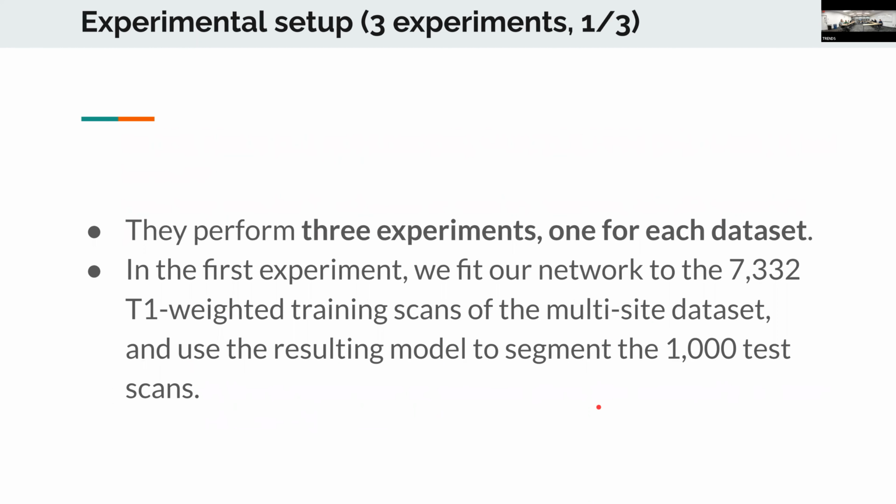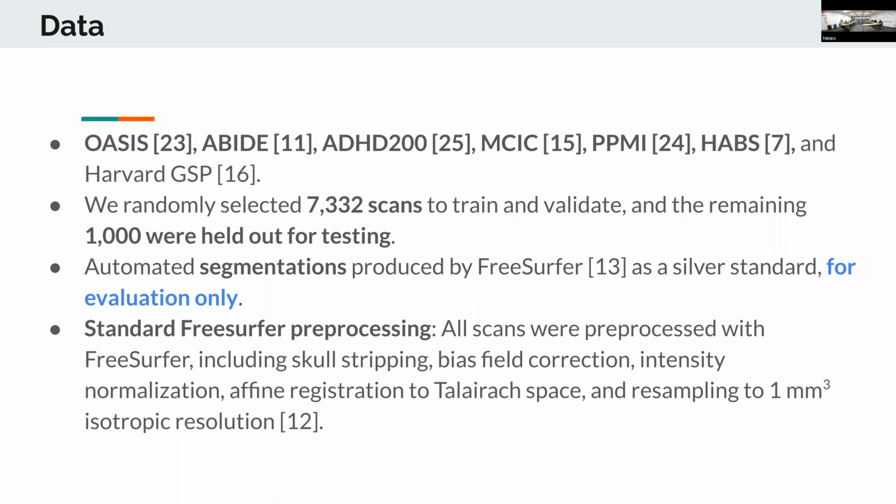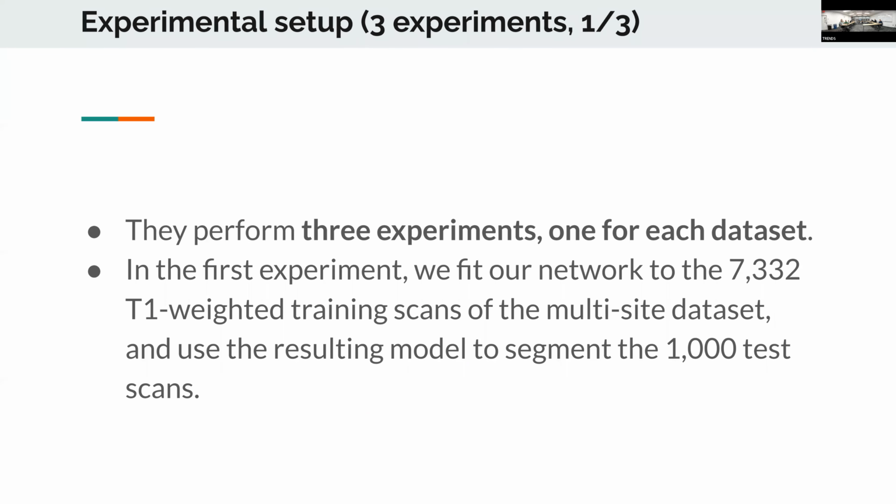You want to make an unsupervised problem as easy as possible, but the fact that they have to do so much pre-processing to get it there is disappointing. You have to use FreeSurfer in the pipeline before you can do anything, and FreeSurfer takes like 4 to 6 hours per subject.